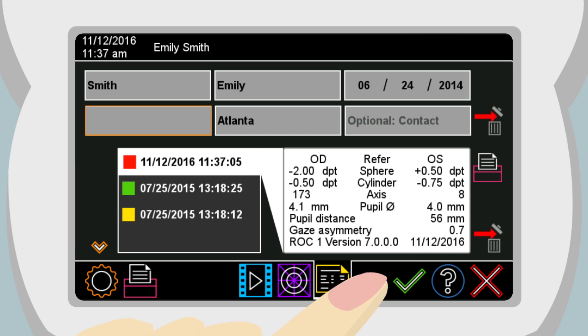For an anonymous measurement, touch the green checkmark without entering patient data. Instead of the patient's name or ID, an automatically assigned rolling number will be used.